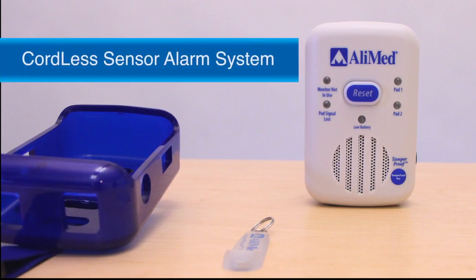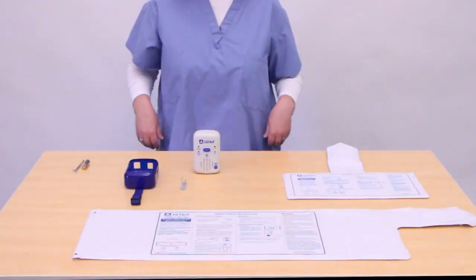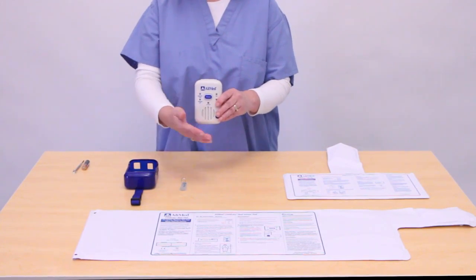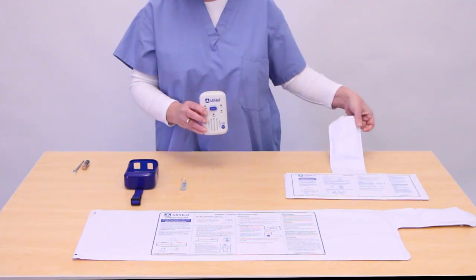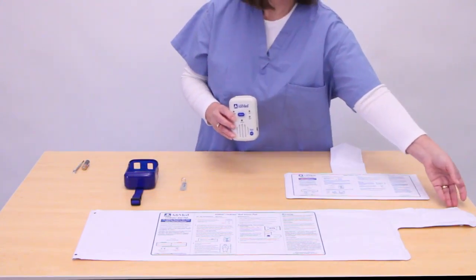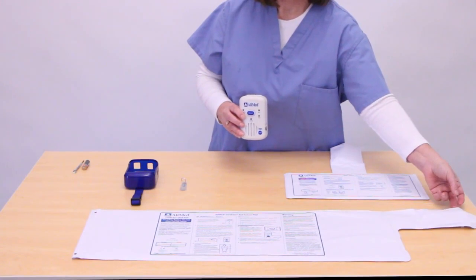Discover the Cordless Sensor Alarm System from Alimed. This convenient system helps reduce the risk of falls by providing patient monitoring without the limitations and hazards associated with corded sensor pad systems. The sensor pads and alarm unit are cordless, which enables greater flexibility in monitor location and alleviates the risk of entanglement or tripping.